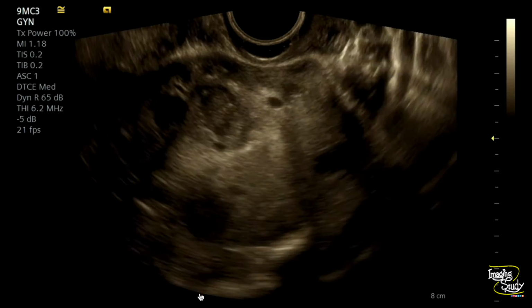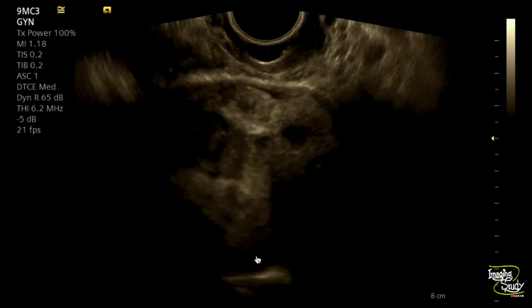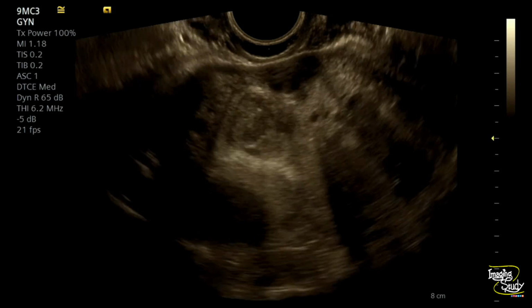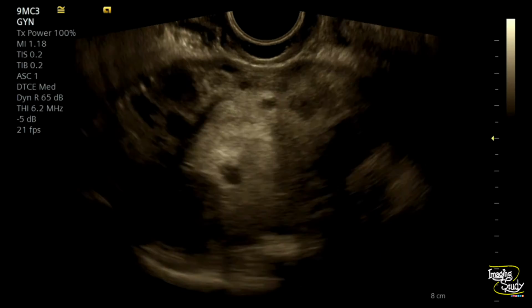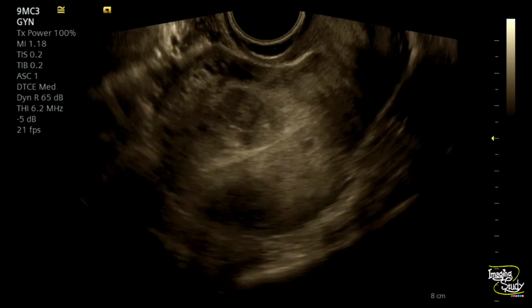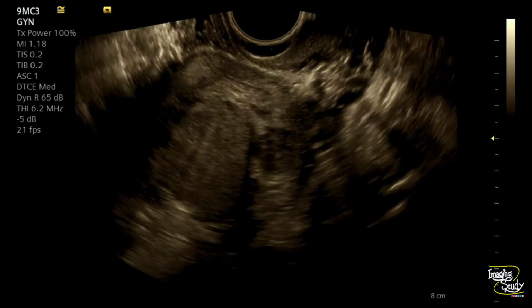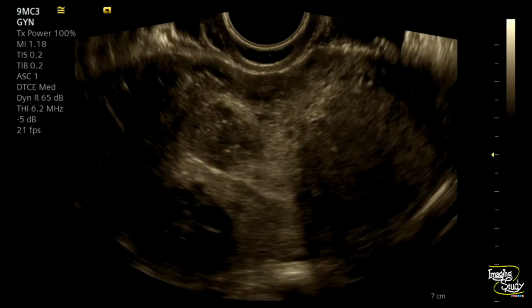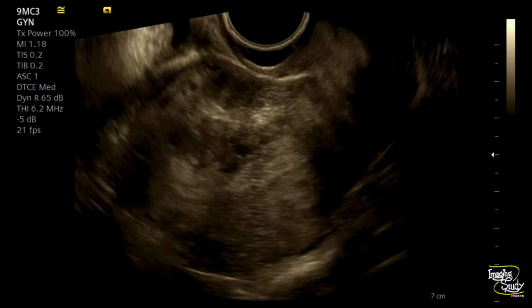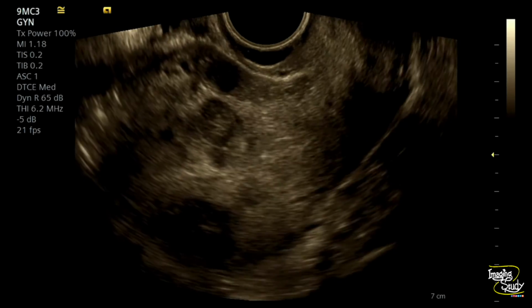Here's the longitudinal section of the uterus in transvaginal ultrasound. You can see diffuse, innumerable, ill-defined hypoechoic areas throughout the myometrium. The uterus looks quite bulky, but it is symmetrically enlarged, not globular like adenomyosis. You can see the endometrial echo here. Here's the transverse section. You can see so many hypoechoic areas of variable size and shape throughout the myometrium. You may call it a case of multiple fibroid uterus, but when you see this type of innumerable fibroids, this is actually a case of diffuse uterine leiomyomatosis.